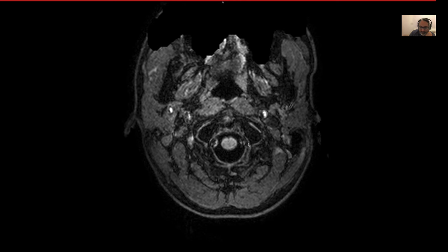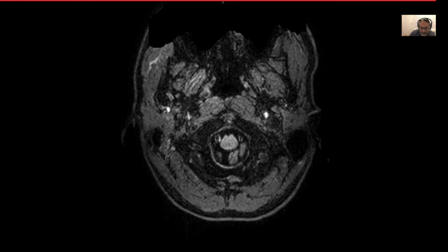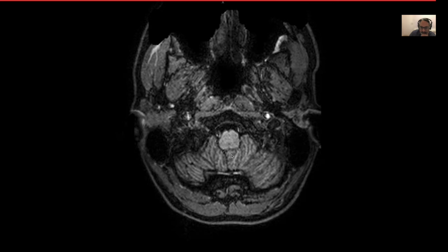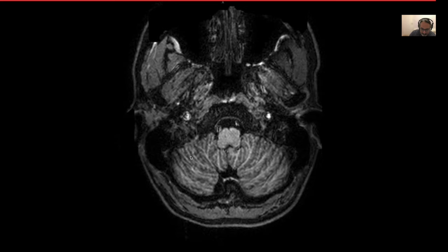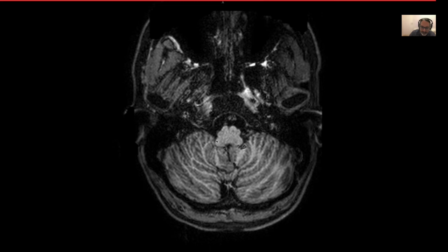So this is the foramen magnum, and we move superiorly from here. Let's do it the other way around. That's the spinal cord. Let's keep moving superiorly. Now here you're going to see the tonsils of the cerebellum show up. They sort of can protrude a little bit through the foramen magnum. That's the tonsils of the cerebellum that show up. Now that's still the medulla, and you've got the cerebellum showing up. So now you can see the cerebellar hemispheres and the vermis of the cerebellum. And this is the medulla.